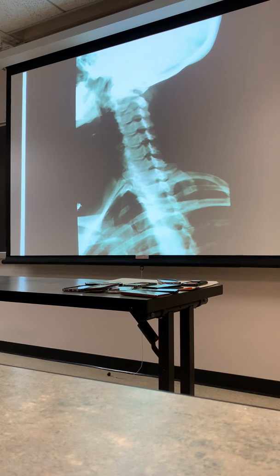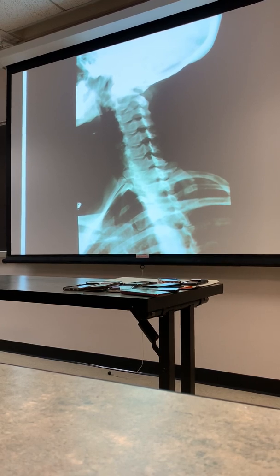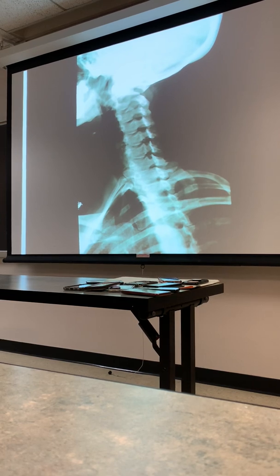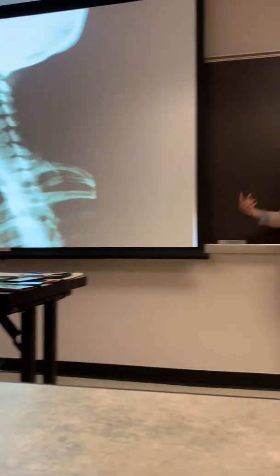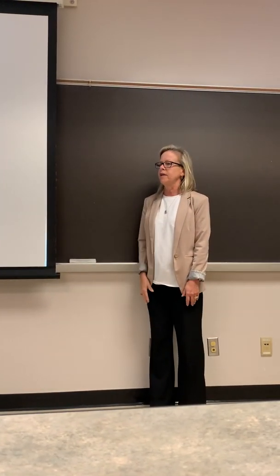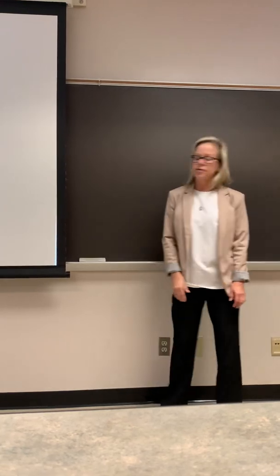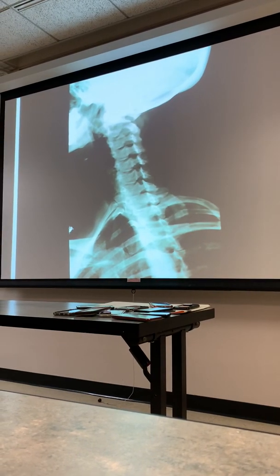Okay, you guys can't see the marker, but there is a marker on there, but just by looking at it, what would you say this was? What oblique? This says RPO. You're right. See the way his face is? So he's like this. So this is RPO. Just look at the mandible. If in doubt, look at the mandible. See which way they're facing. Right, so that's an RPO. So, do you see the intervertebral foramen?